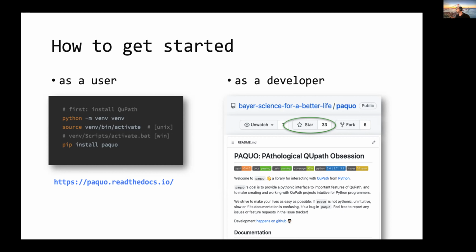So when you create a QuPath project with, I don't know, 100 images, it'll take a while. Like we already got rid of a bug that made it quadratic and not linear. So now at least it has linear time to add the images, yeah.